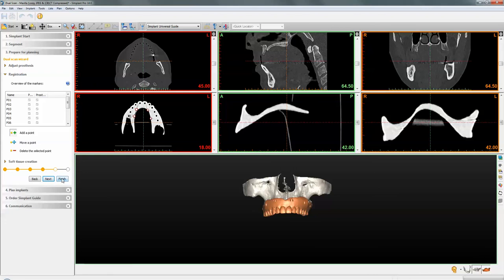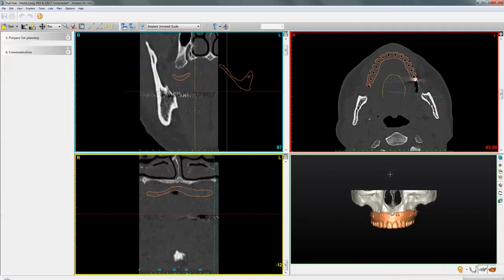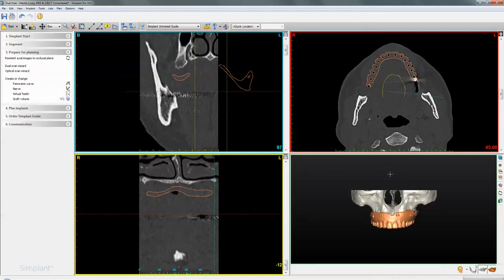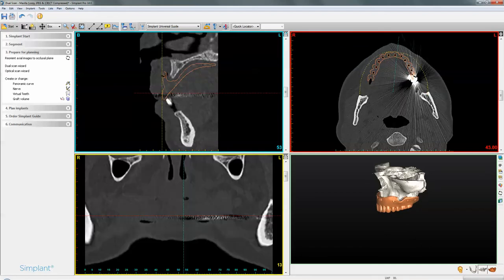Once the merge is complete, click Finish. Once the calculation is completed, you will now have the prosthetic envelope within your plan to go ahead and continue with the implant planning. This completes the video tutorial on the dual scan technique. Thank you very much.